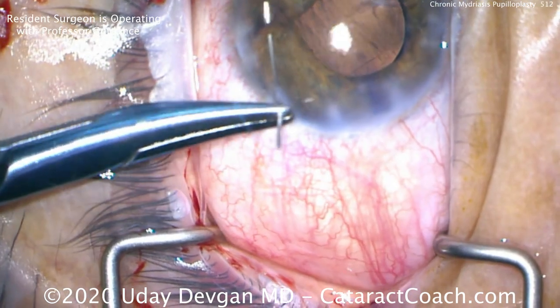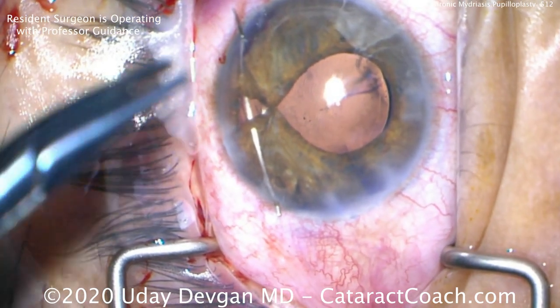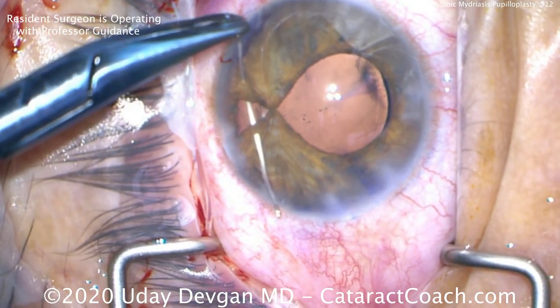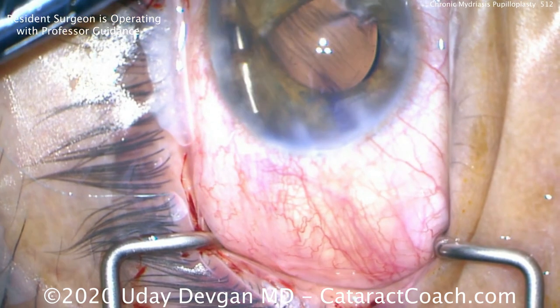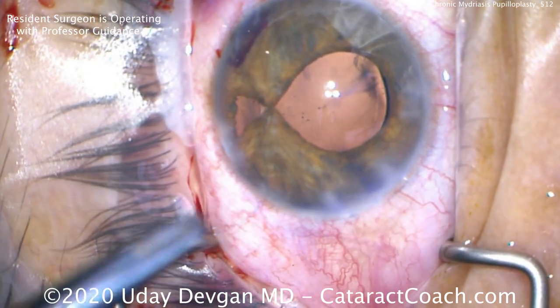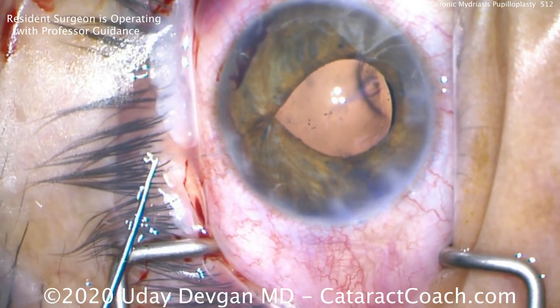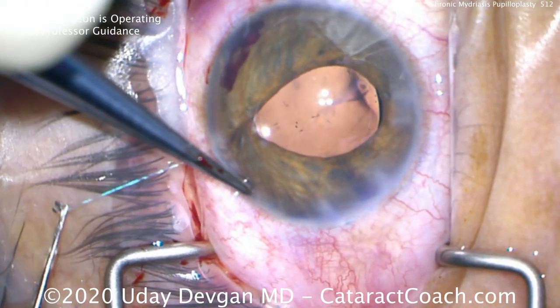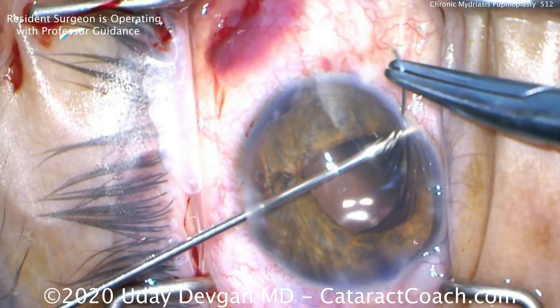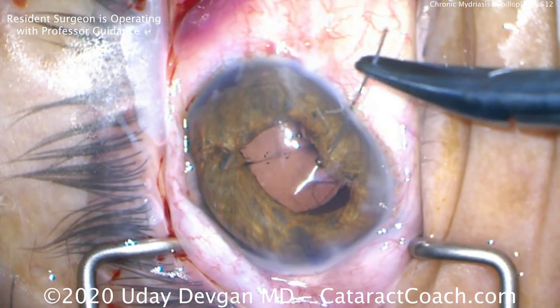Now we'll do another one inferiorly, but let's close this triangular-shaped gap. To close this gap, we're going to use that same 10-0 prolene, but this time a different technique. Right in the middle where that triangular defect is, there's a paracentesis — so let's use this as a learning opportunity. Let's teach the McCannel technique. We've passed it through, and to tie this we'll bring both ends out through that paracentesis, since it's right near the triangular defect, then tie them together. Be careful not to pull the iris too much, or you'll end up cheese-wiring or even disinserting it. We close the superior defect, but the pupil is still too big and de-centered, so we need to address that.